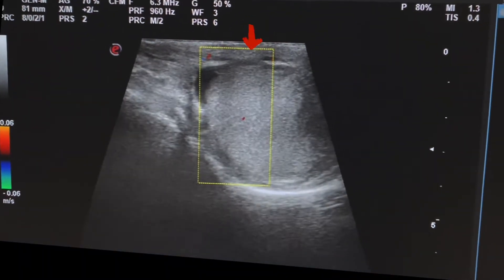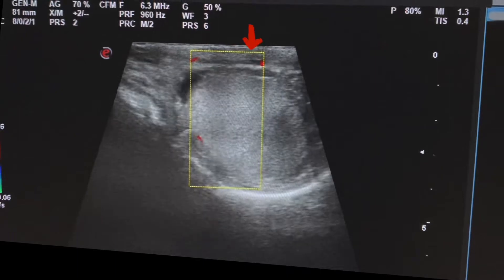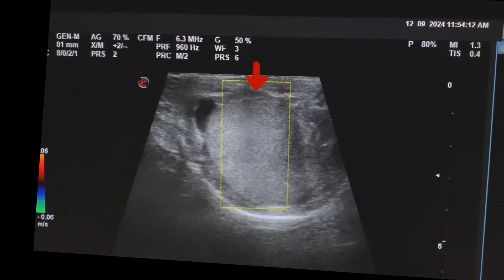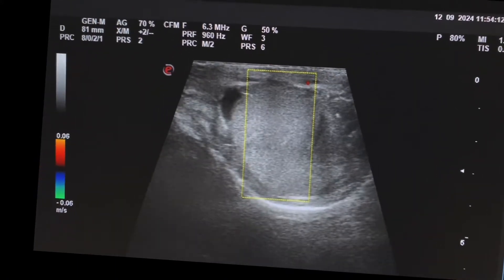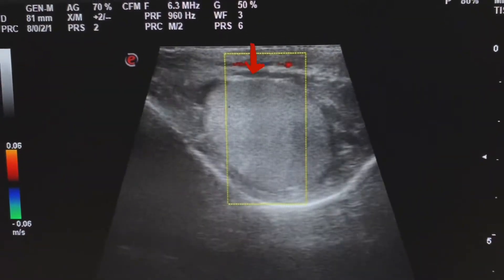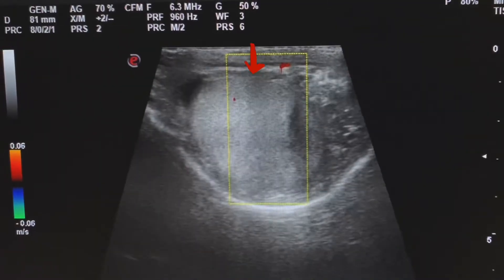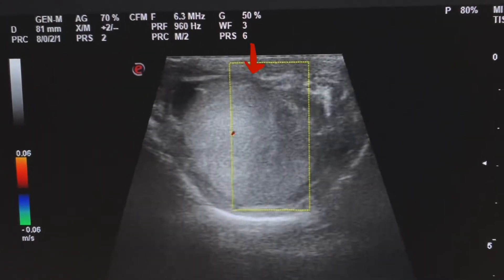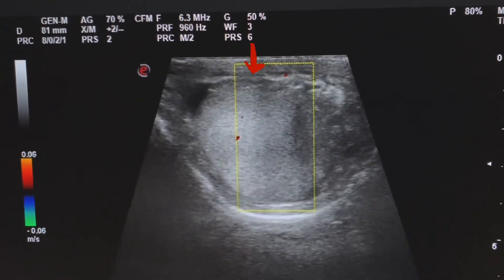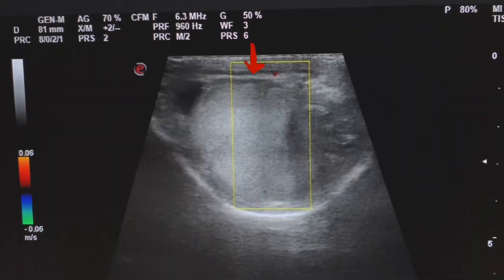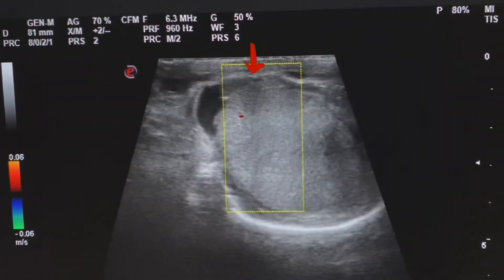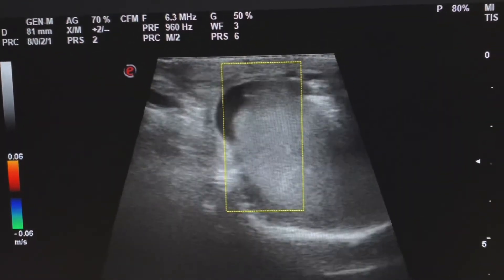On color Doppler, when the testes is normal there will be minimal flow. And when there is inflammation of the testes, we will see flow all over the testes.